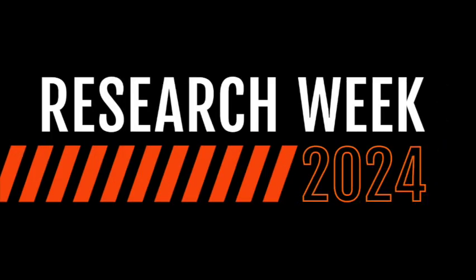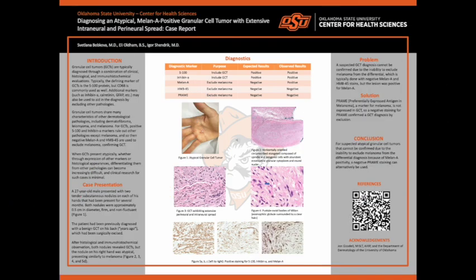So our poster is diagnosing an atypical Melan-A-positive granular cell tumor with extensive intraneural and perineural spread. Case report. Granular cell tumors, GCTs, are typically diagnosed through a combination of clinical, histological, and immunohistochemical evaluations. Typically, the defining marker of GCTs is the S100 protein, but CD68 is commonly used as well.